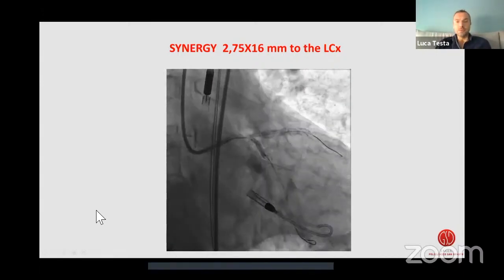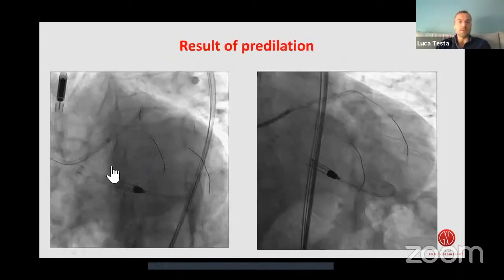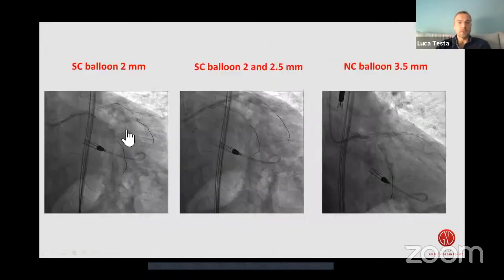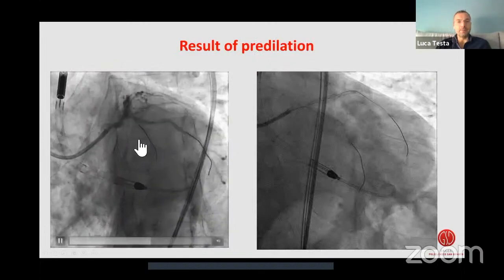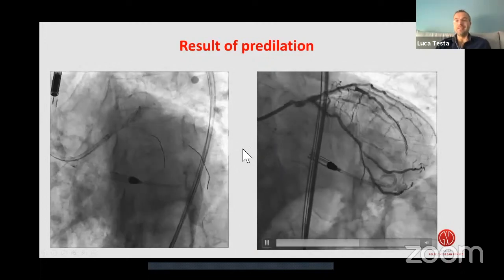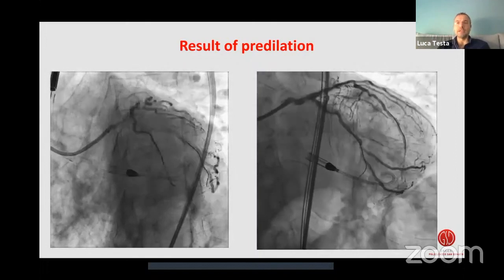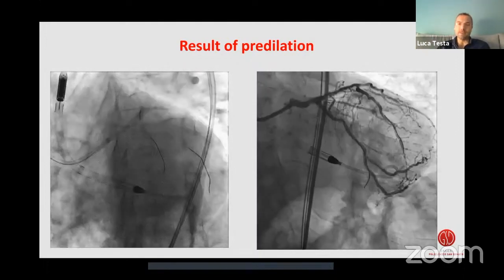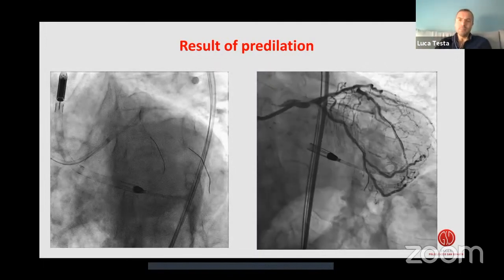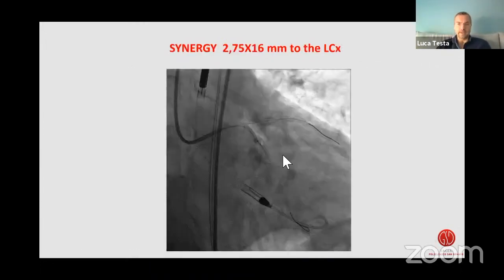My intention was to go with a 2 stent technique with minimal protrusion to the LCX. I want to discuss with you this choice, in particular looking at the angle of the LCX. I believed that it was absolutely suitable for a kind of T-stenting. Of course, guidelines and experts suggest the DK crush, and some more complex approaches. But I have to say, in that case, I felt very comfortable to start doing this kind of technique.